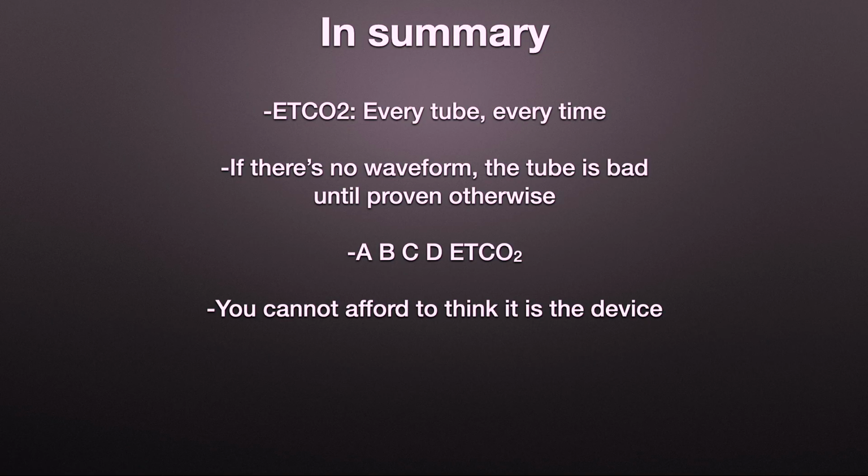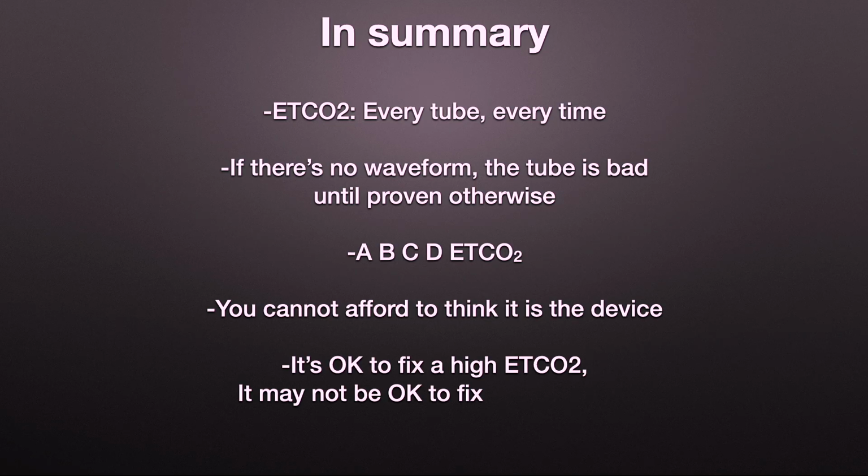When you're measuring end tidal CO2 and you don't get a convincing waveform, you either have to prove it or do something else. And it is okay to fix a high end tidal CO2, generally speaking, but it may not be okay to fix a low end tidal CO2 if you don't know the whole picture of the patient's acid-base balance. And that can cause real problems real fast if you do it in the wrong way.